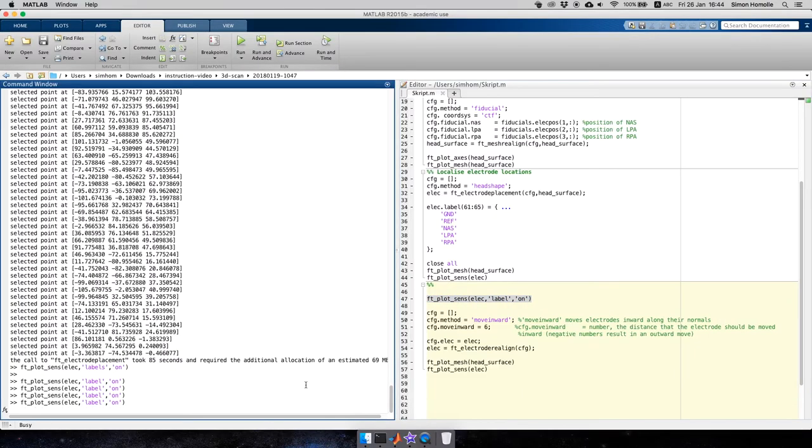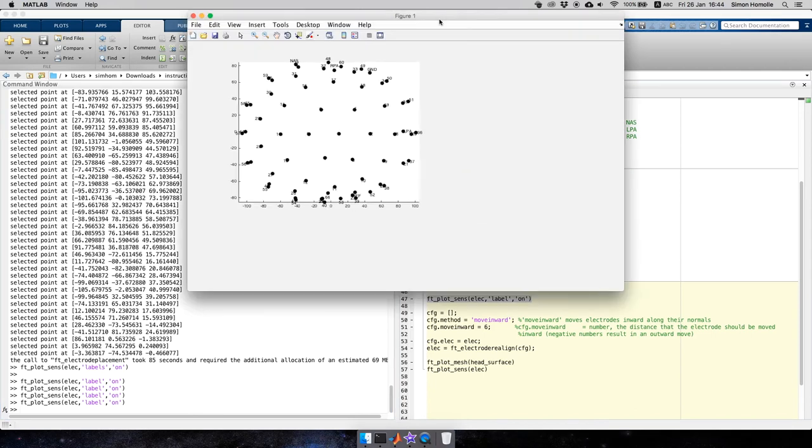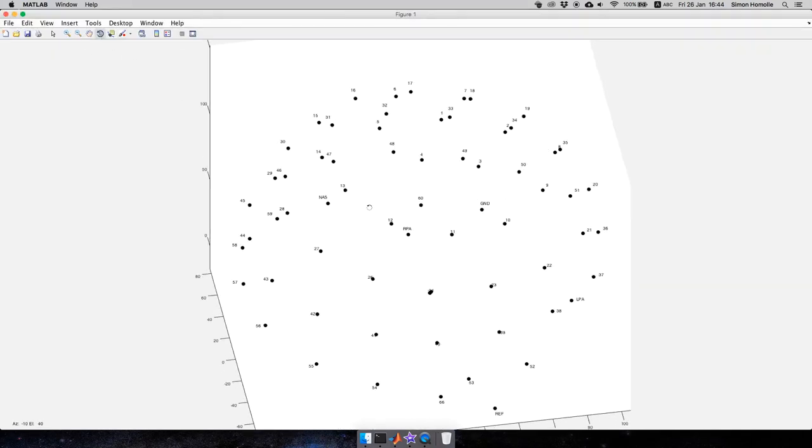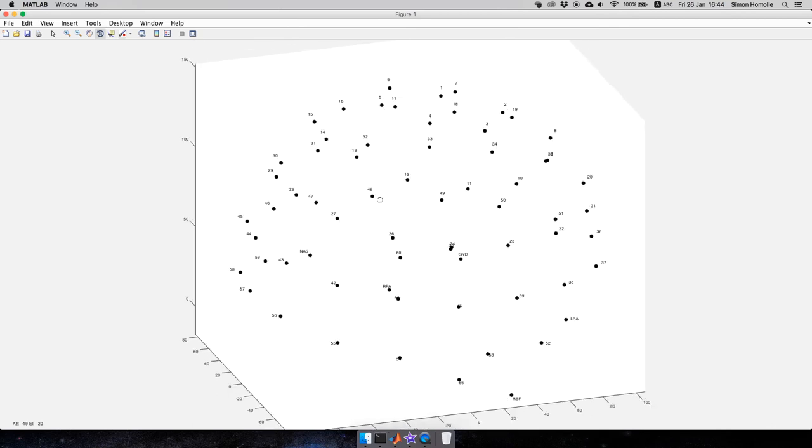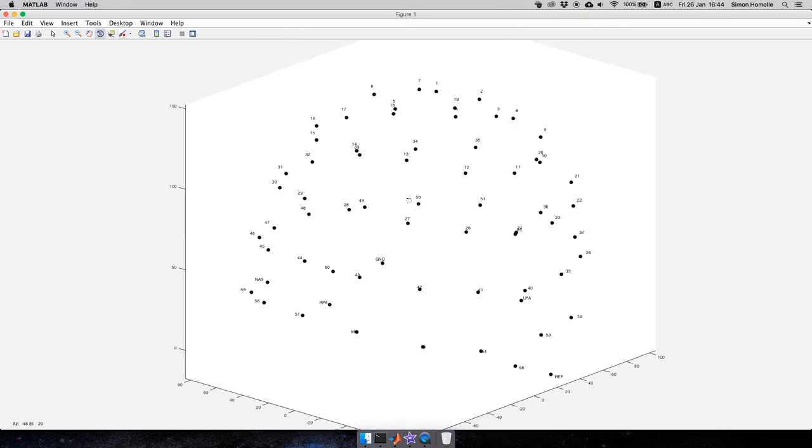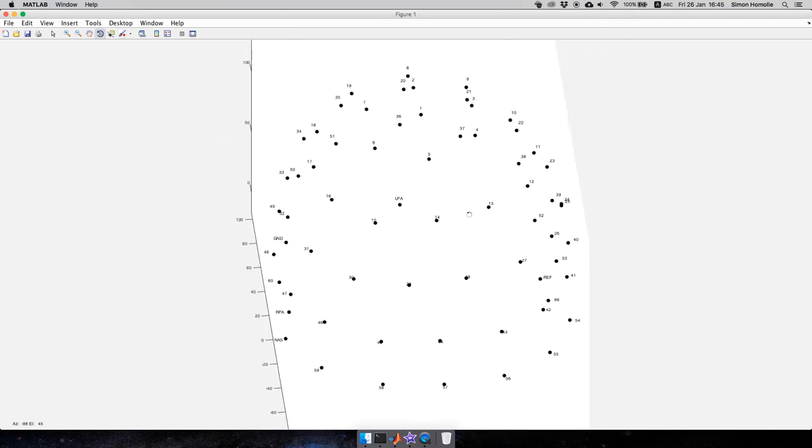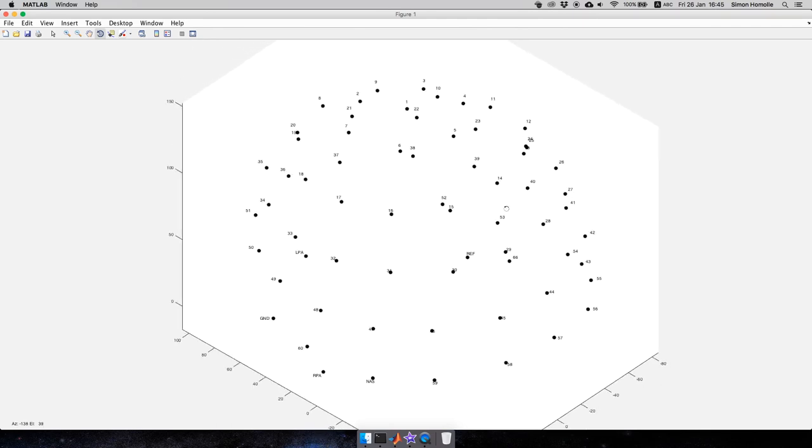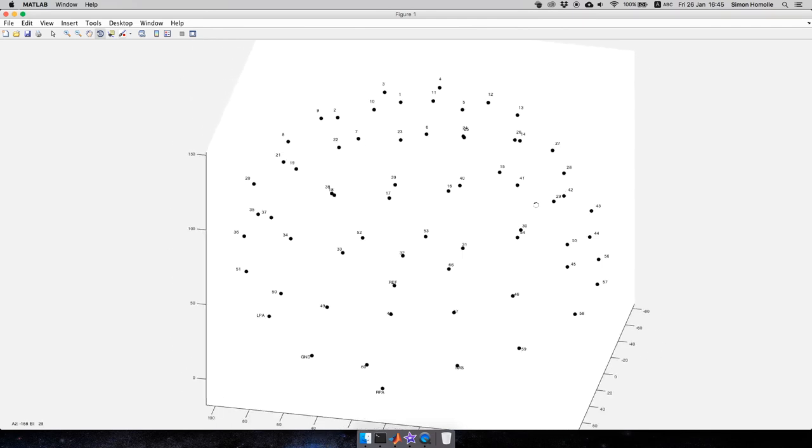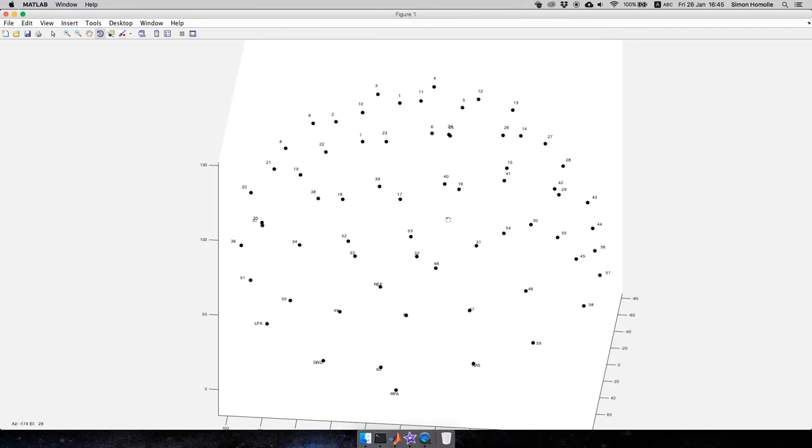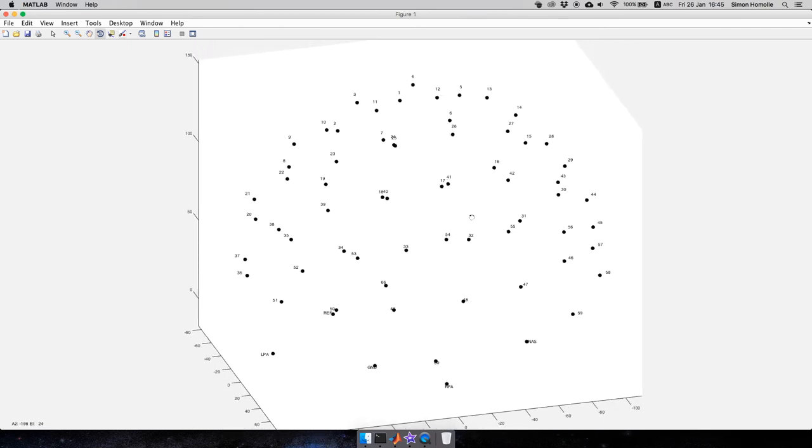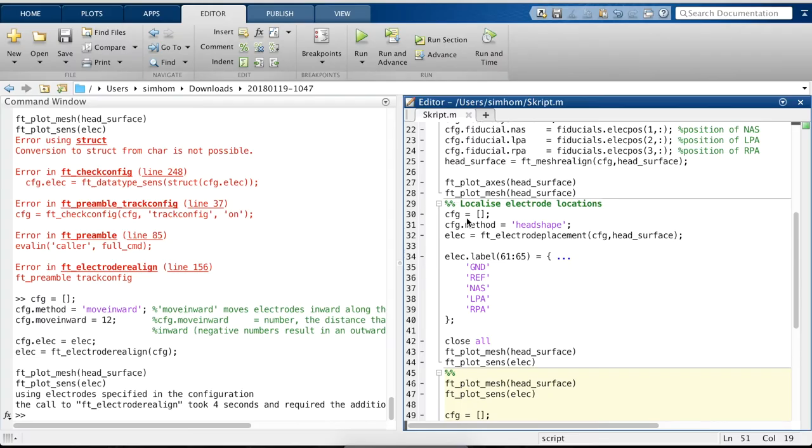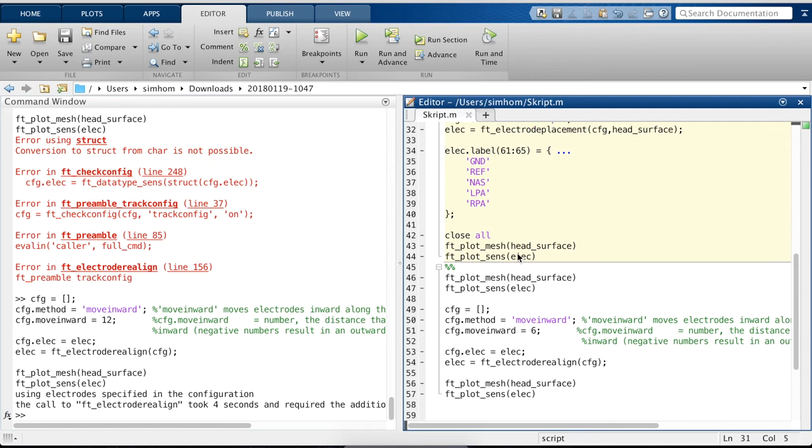So the next thing we can also do is see the labeling and check the labeling. For this case, we use the easy cap M10. So the ordering is like one, two, three, four, and so on to the 61st electrode. And we also have the fiducials, the grounding, and the reference. Here we can also check again. So if something is labeled wrong or we just missed something, but it doesn't seem like that.